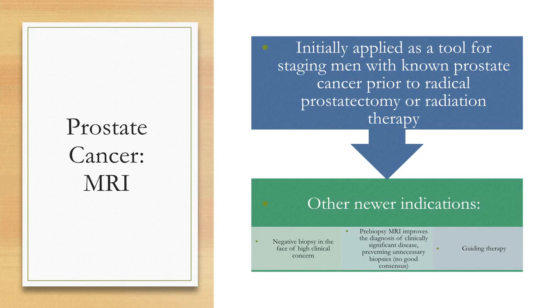Moving on then to prostate cancer. So the main thing that radiology has a paradigm with prostate cancer is MRI. We're doing more and more MRIs of the prostate gland. It's not a comfortable study for men. We were talking about the wires in the breast. Prostate MRI uses an endorectal coil. So it's not the most comfortable exam, but it is a very good study to look at the prostate gland.